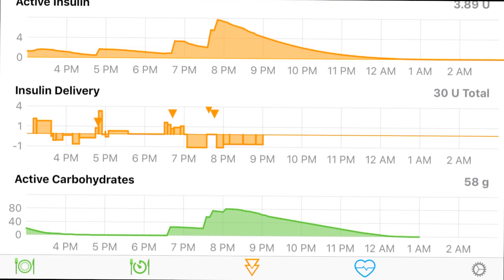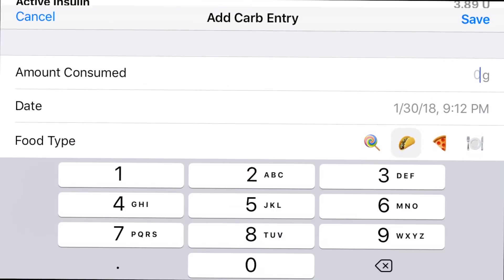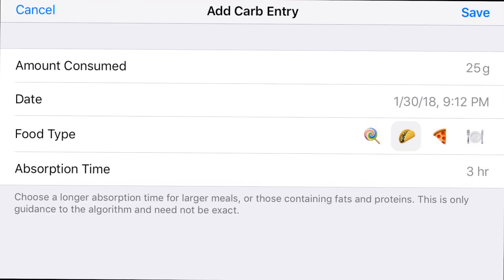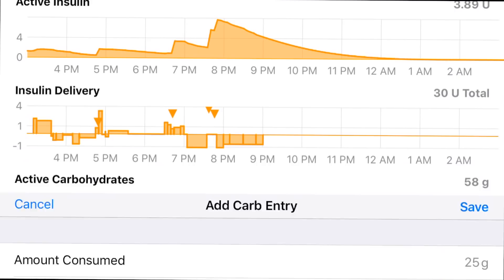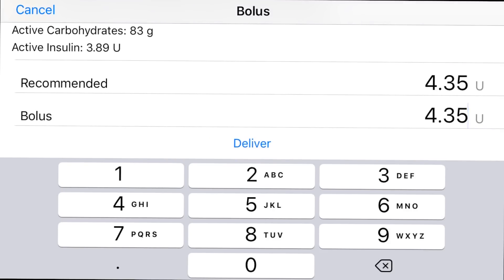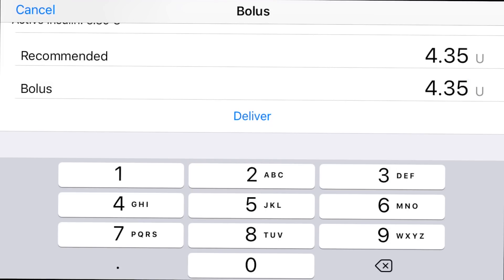Now I'll show you how you bolus. In the bottom left-hand corner, you tap that dinner plate icon and it prompts you for how many carbs you're eating — say 25. There are three types: a lollipop for high-carb fast-burning foods, tacos for the roughly 80% of standard meals, and pizza for high-fat high-carb meals like peanut butter or anything with a lot of cheese. If I select taco and save it, it prompts me to take 4.35 units. Tap the top to match it on the bolus, accept it, hit deliver, and it goes right to my pump from my phone — that's what you saw in the intro.